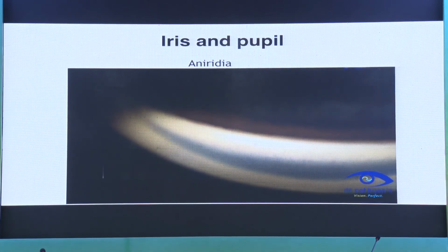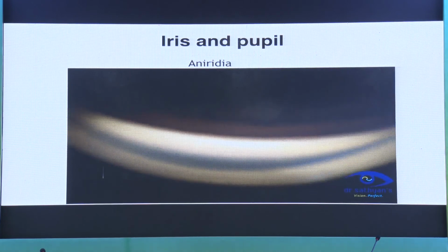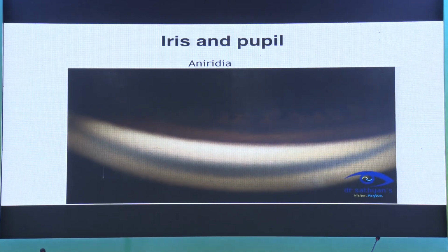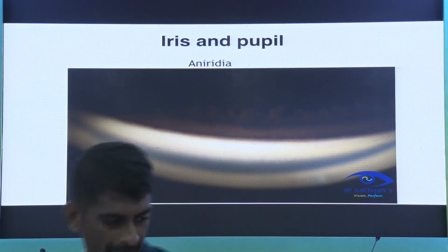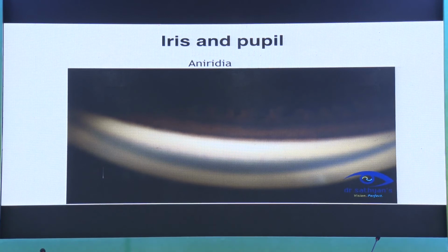And whenever you are doing your trabeculectomy, especially in patients with neovascular glaucoma, where you have treated with Avastin injection and the neovascularization is completely gone, when you want to do a trabeculectomy you still have to do the gonioscopy to make sure whether there are any angle vessels or not. Wherever there is no angle vessel, you pick up that area to do the trabeculectomy.